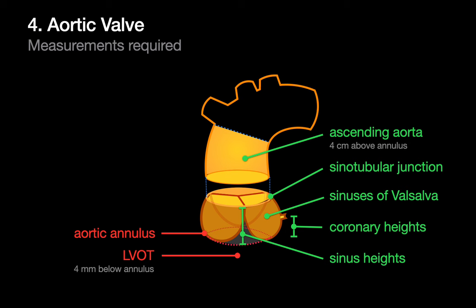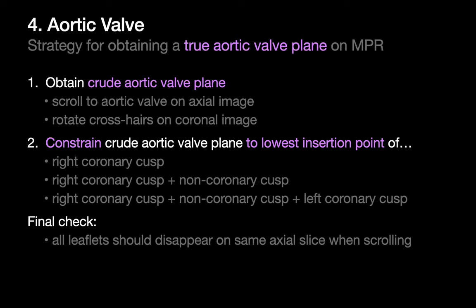In order to help folks appropriately select and size the TAVR and avoid any foreseeable complications, you'll provide measurements of the aortic annulus and LVOT during systole and a few other measurements during diastole — the systolic ones indicated in red and the diastolic ones in green. In order to provide all of these measurements accurately, you'll need to work off of a true aortic valve plane using the MPR tool on a 3D workstation. It's a two-step process: obtaining a crude aortic valve plane, which takes seconds, and fine-tuning it to a true aortic valve plane.